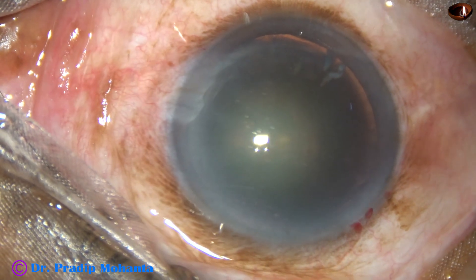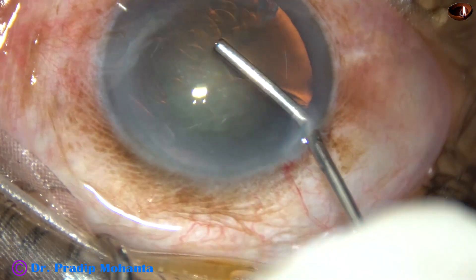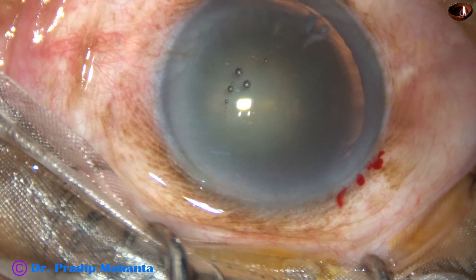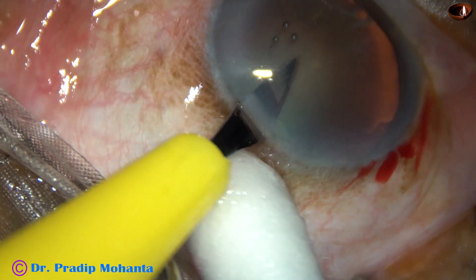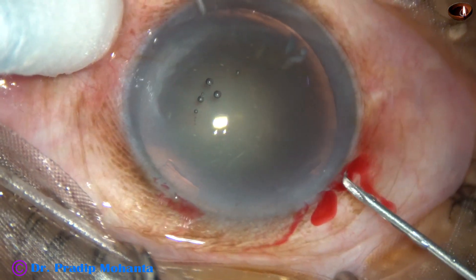This is the main incision on the posterior aspect of the limbus. Now 2% hydroxypropyl methylcellulose is injected into the anterior chamber. And then one side port — only one side port has been made in this case, on the left side of the main incision.